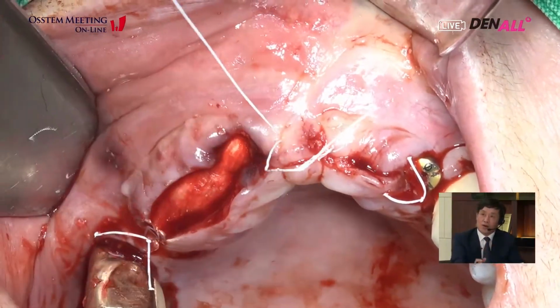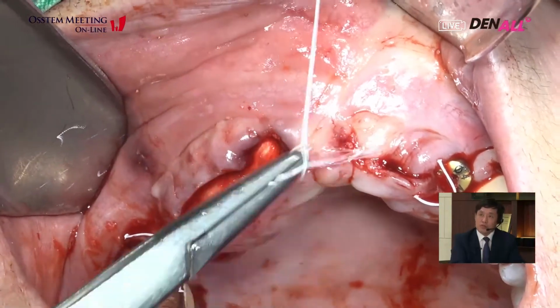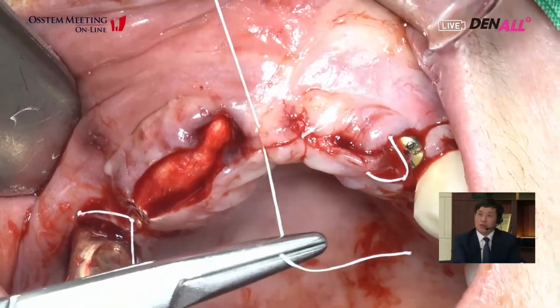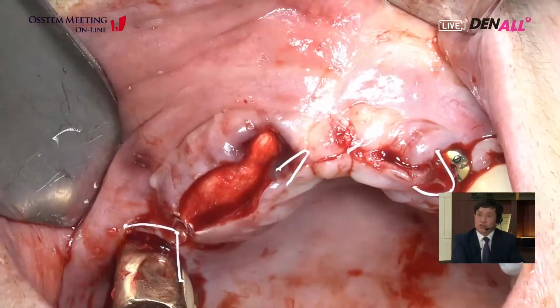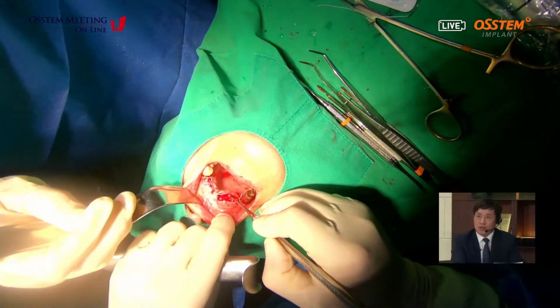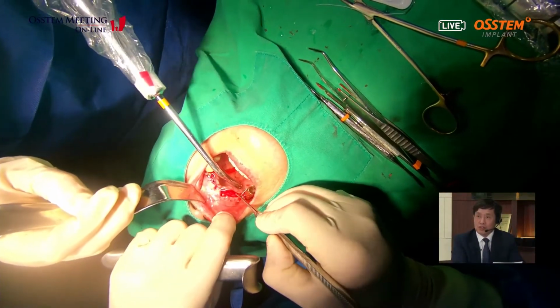Yeah, Dr. Kim already did a sufficient periosteal releasing incision, so even with immediate implant after extraction, you can see the flap is in very good approximation without exposure.